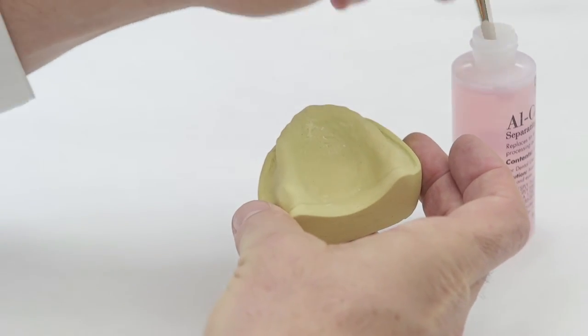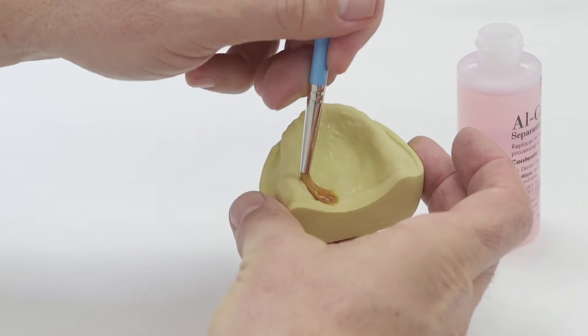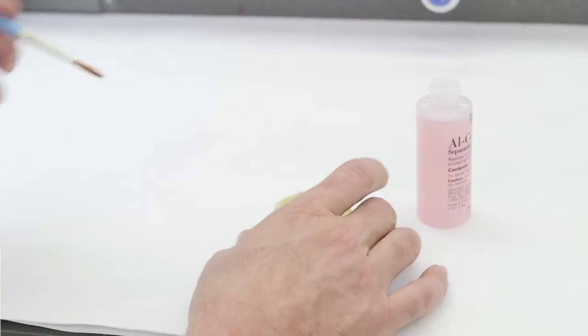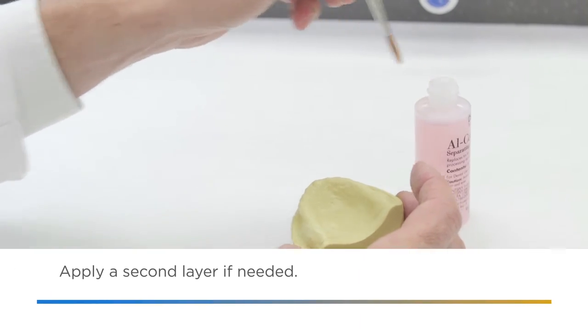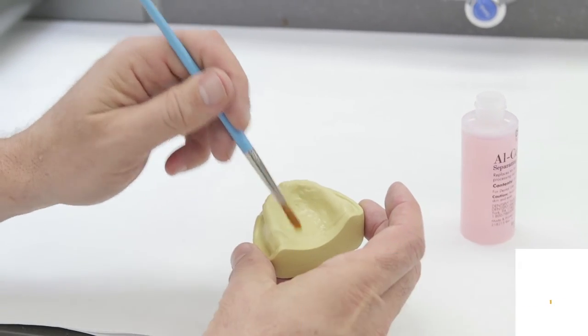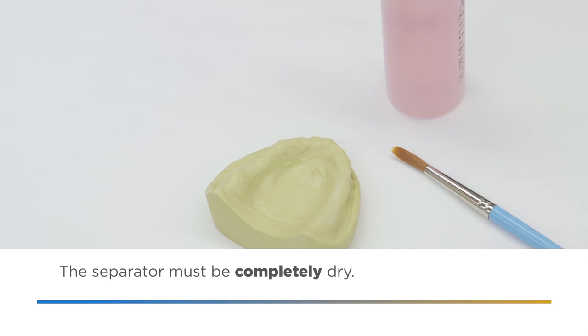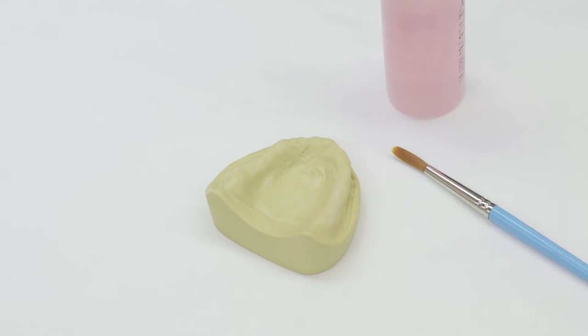Use a brush to apply a thin coat of all coat separating agent to the cast. Do not allow the separator to puddle. Apply a second layer as needed. Make sure the separator is completely dry before placing it back in the mold. If it is not completely dry, blanching may occur.